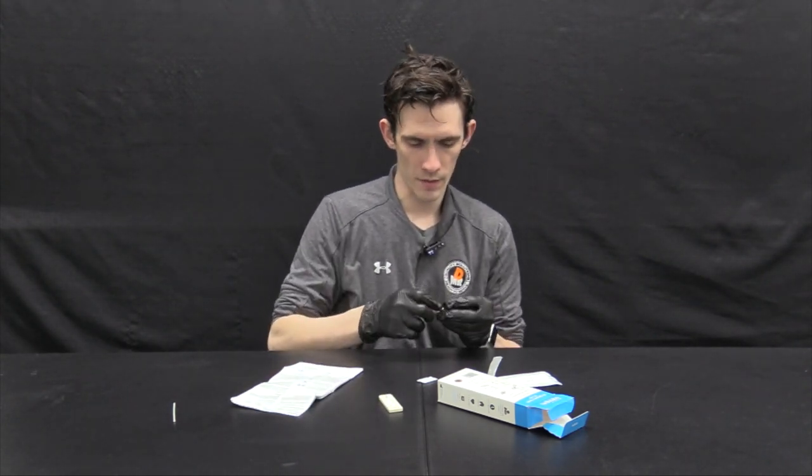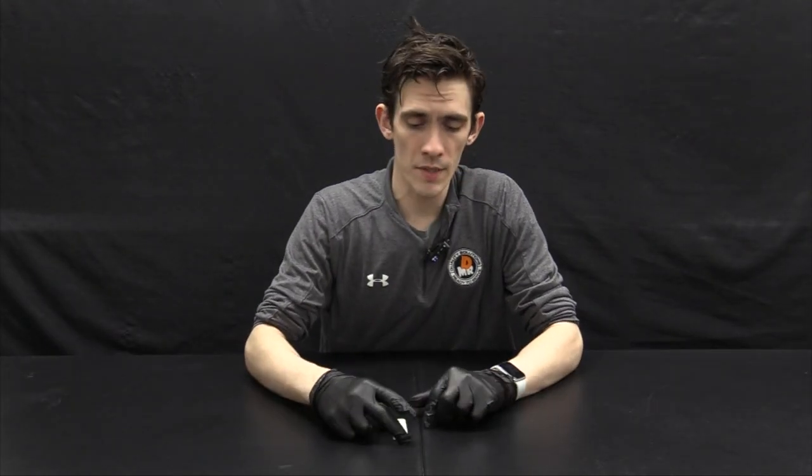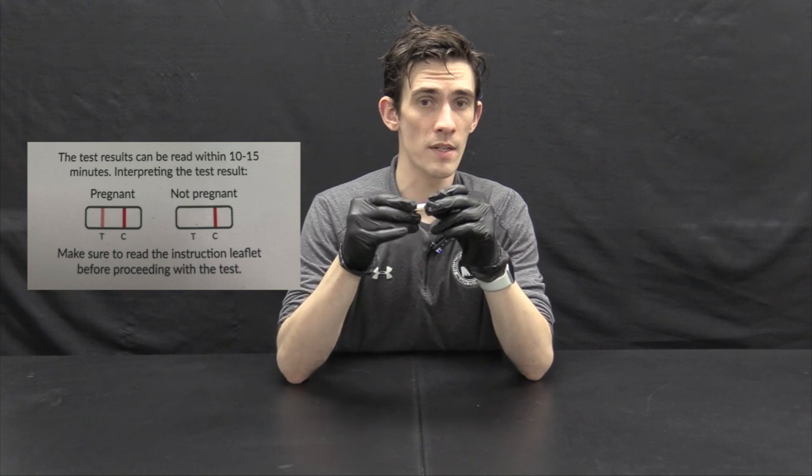So we had two large drops and now we're going to wait ten minutes and interpret the test. The last step is test interpretation — try not to interpret before ten minutes after the sample buffer mixture is added. After ten minutes, you can set a timer for a close approximation, then look at the test window. As indicated in the instructions, two lines — no matter how faint the T line is — will indicate a pregnancy. Relaxin is only found in pregnant canines, so that will confirm we do have a pregnancy.